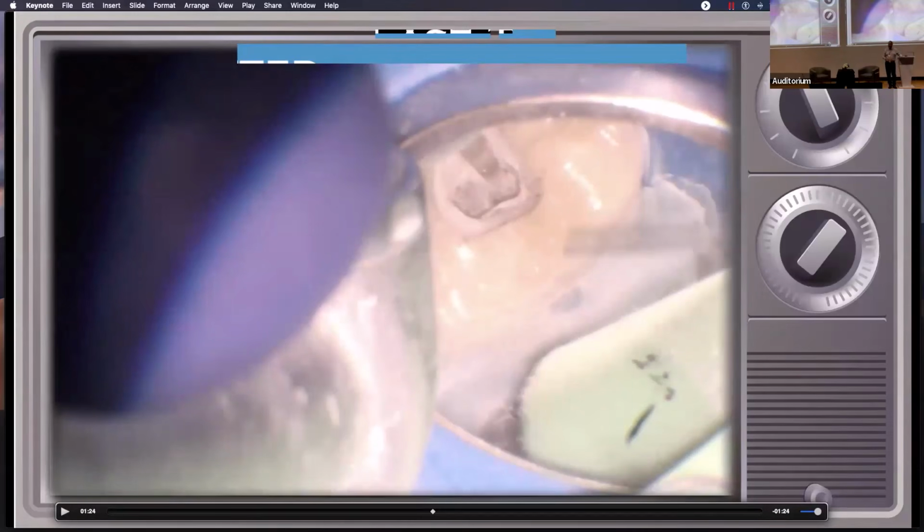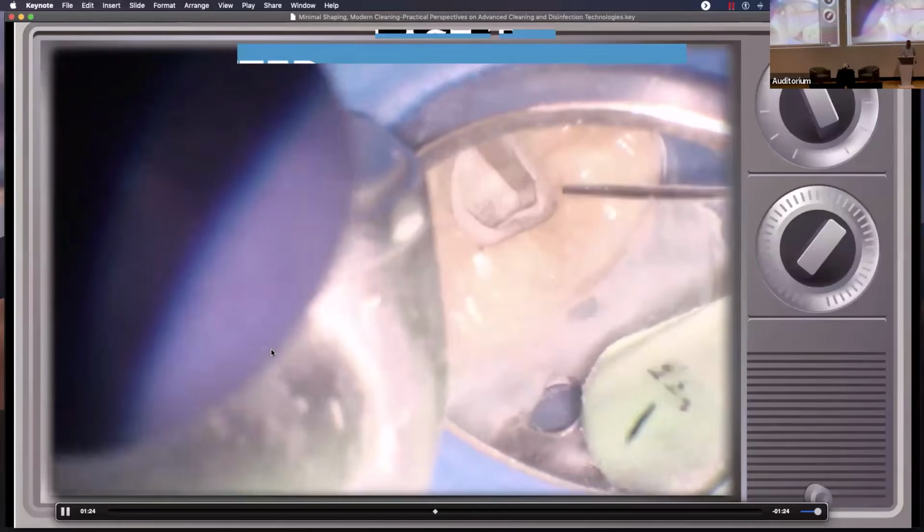Yep. Karen asked, is that a Stropko blowing air? It's an air-only Stropko when the chairside's running it. Yeah, that's how we find calcified canals. I had a chairside assistant ask one time when I was giving a lecture, I was kidding around with her, I said, what's an explorer for? And she said, I don't know, checking for anesthesia? She really didn't know that an explorer was for finding canals. Yeah, we found that canal without picking up the explorer.